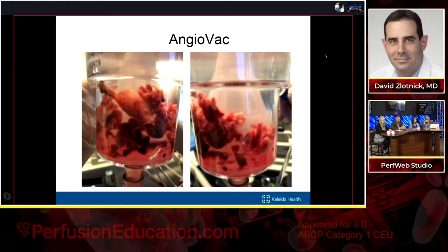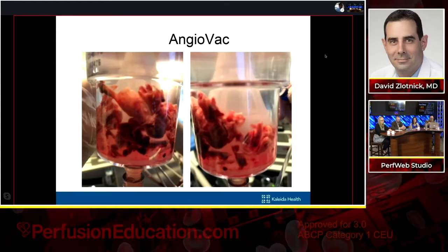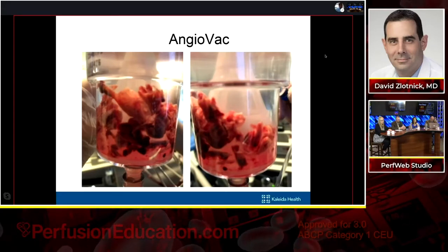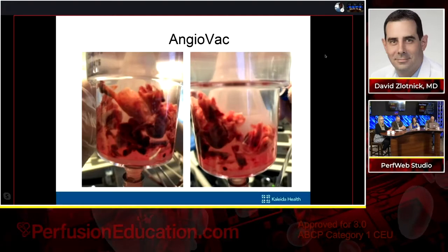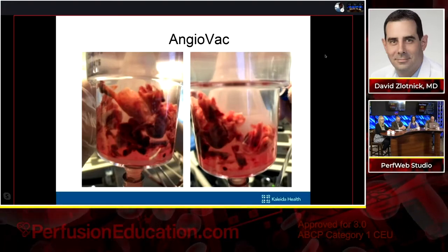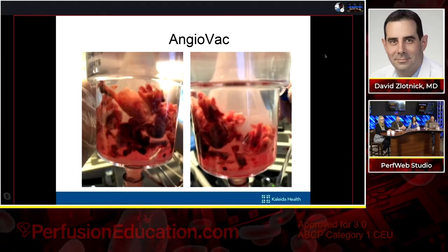Now again, for these cases, this is not clot that we're going to be able to readily see on a transthoracic echocardiogram. So for these patients, we have to intubate them and use TEE imaging to see. For all the SVC patients that I've done, we've always gone from below and intubated with TEE imaging.